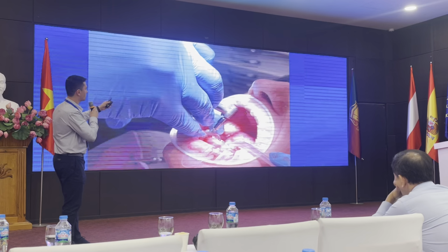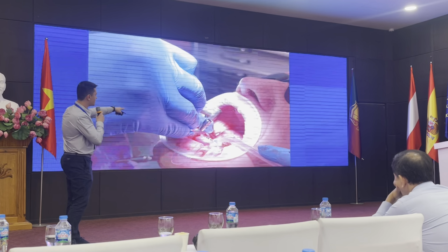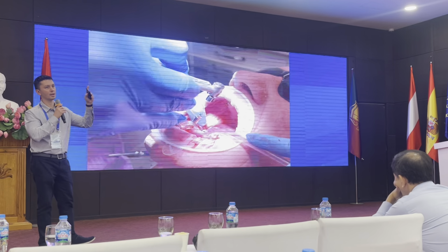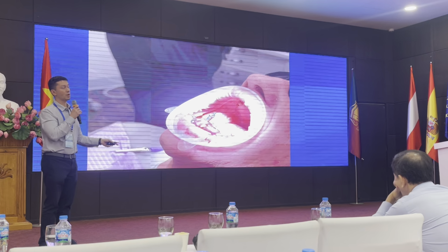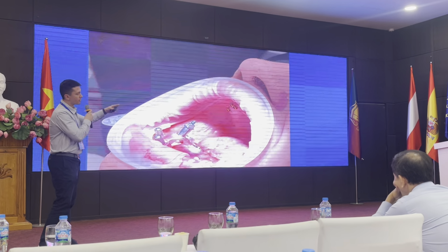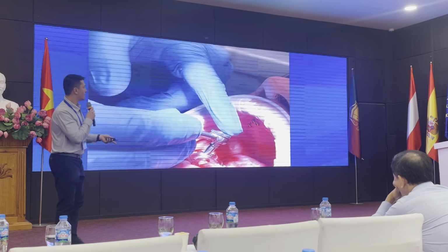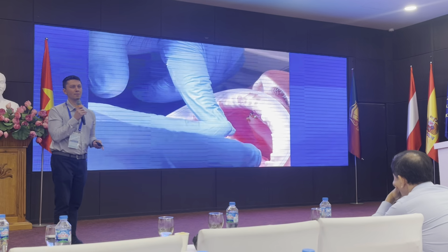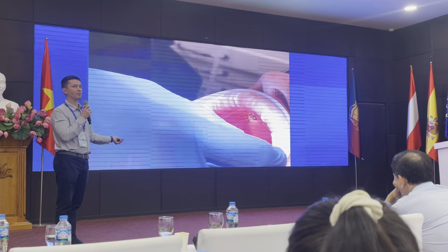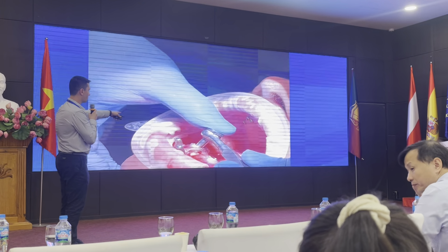So we did all that, we went through all the drilling sequence, now we're placing our first implant. So when these implants get placed, I place the implants through the guide. You don't have to do it this way. You could just drill through the guide and then take off the guide and then place the implants without the guide there. But to me, why would I do that? I might as well just use the guide to place the implants through it. It's even more accurate. We're getting a lot of stability here.